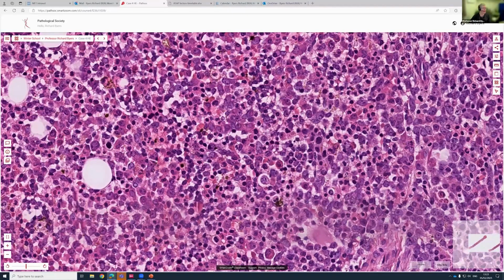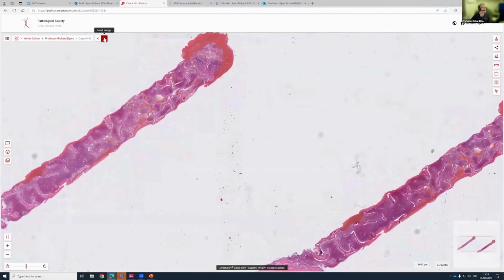But in this case, you've got indistinct nucleoli, kind of clumped or stippled chromatin. The cells look slightly different from each other. It's more likely to be acute myeloid leukemia, but you can only really decide that based on the immunos, both on the flow cytometry and the immunohistochemistry. I'll just pass over the retic for that one.